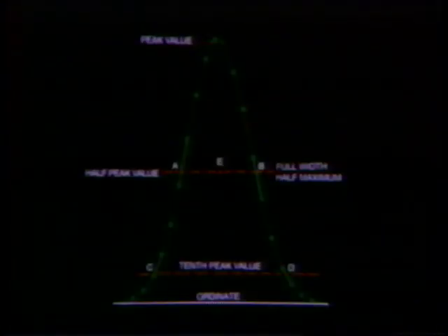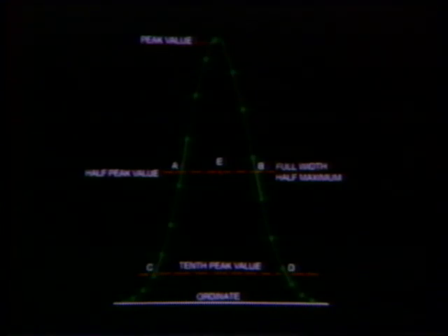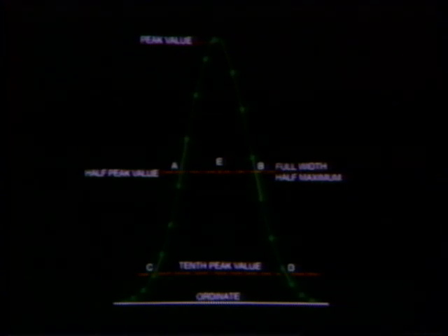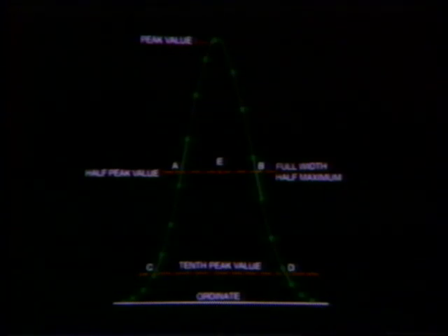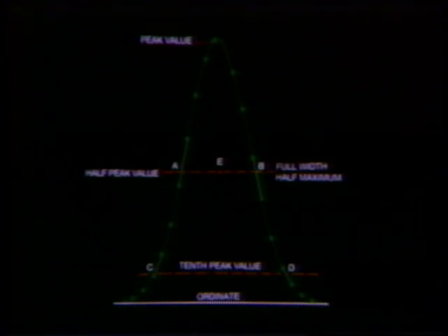Another measure of spatial resolution is known as the full-width half-max resolution, and is probably the correct method to accurately determine the resolving power of the camera. But it is a difficult test to perform, requiring a computer and special software. For the purposes of this discussion, you should remember that most resolution specifications are quoted as full-width half-max values, and the typical specification is 4 millimeters full-width half-max.